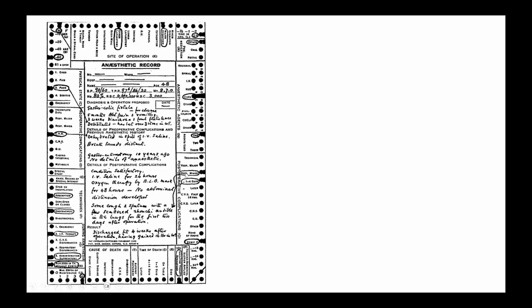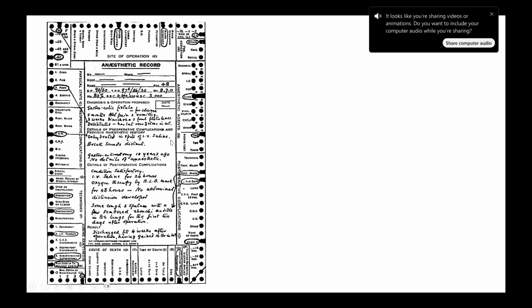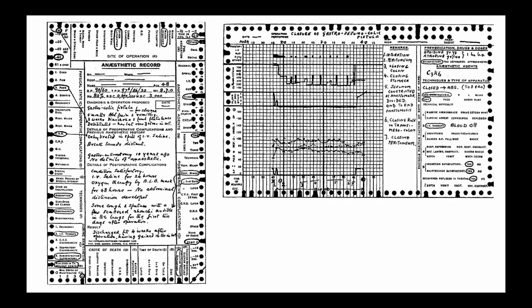So once you understand that, I go back to show you a picture which was used during my PG days, when I went for my PG in 1976. This is the record that we used to use. Can you tell me the name of this, what is being shown here? If you go through the picture, you will have some idea about what is being shown here. So this is one single monitoring paper chart. Single paper?